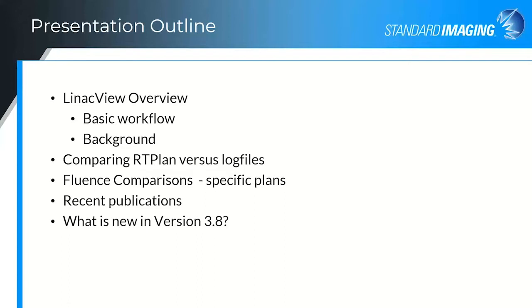Then I'll discuss a few recent publications comparing log file versus detector array comparisons to show what correlations exist and differences in what errors can be picked up by each. Finally, I'll review some of the new features in version 3.8 and then summarize.